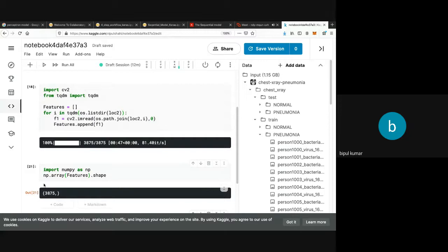You should take care whenever you train a model: you have to train it on data which is uniform in shape. It is not possible that the first sample contains 100 features, the second only 20, the third 80, the fourth 70. If we are using data, then all the samples should have uniform features. First sample 100, second 100, fourth 100, everyone should be 100, right?